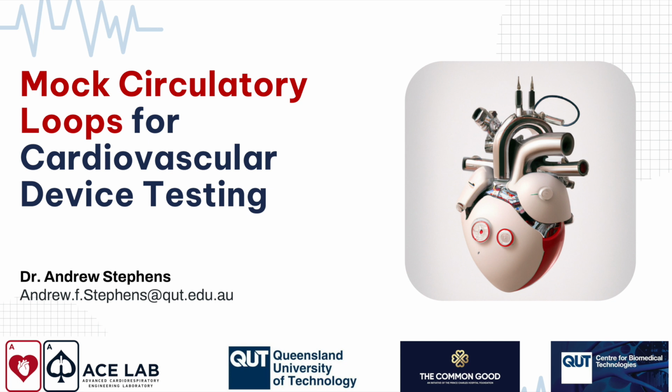Here's another one that uses, instead of air, a pusher plate to actively compress and decompress the air trapped inside. So compliance is important. If you don't have the proper compliance in your mock loop, your pressure waveforms will not look right, and your flow will be too high.